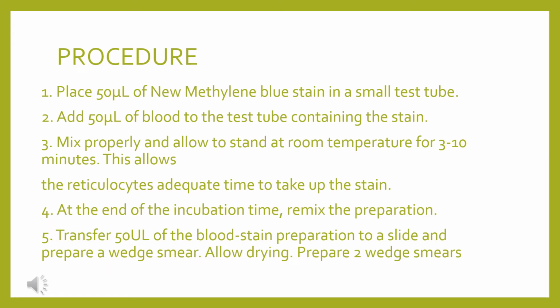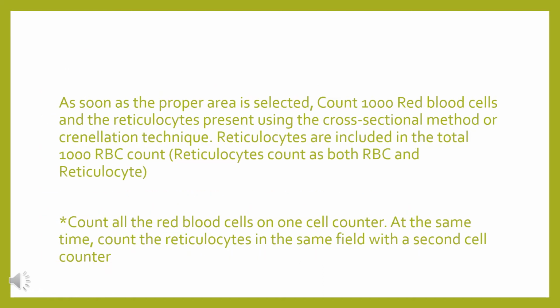At the end of the incubation time, we remix the preparation and then transfer 50 microliters of blood stain preparation to a slide and prepare a wedge smear. So allow it to dry and then prepare 2 wedge smears for confirmation of both your calculations.